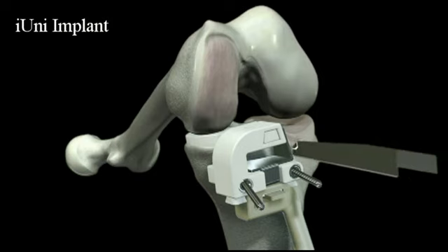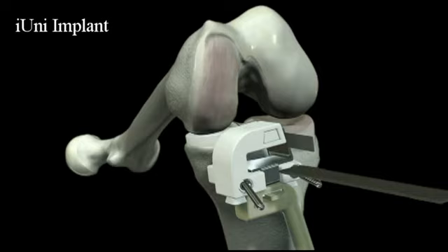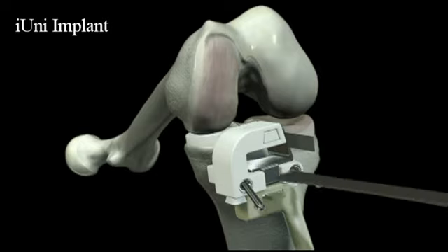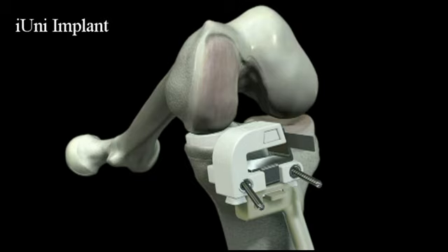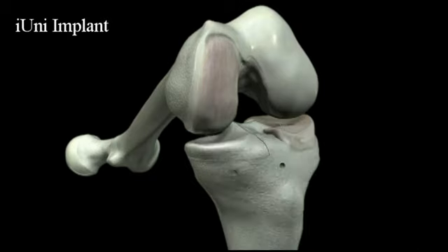The saw blade should be flat against the metal cut guide. The reciprocating saw blade can be left in to protect the ACL insertion while performing the axial cut. Then perform a horizontal tibial cut using the tibial iJig. Remove the tibial iJig followed by the resected bone segment.